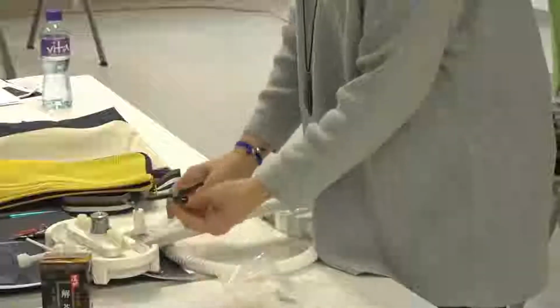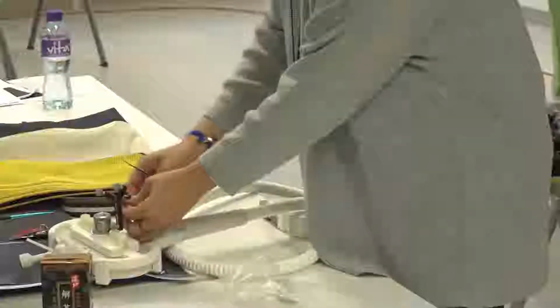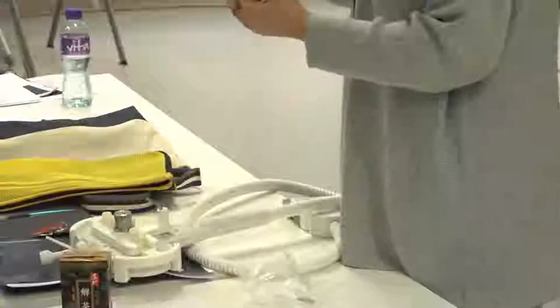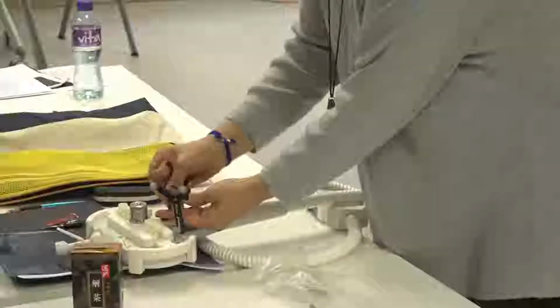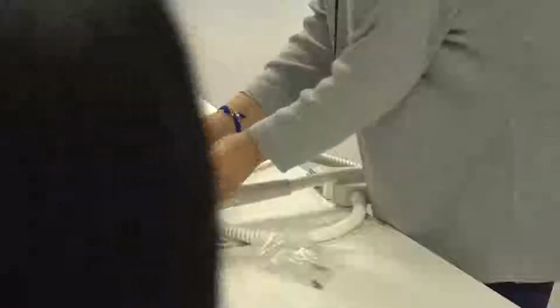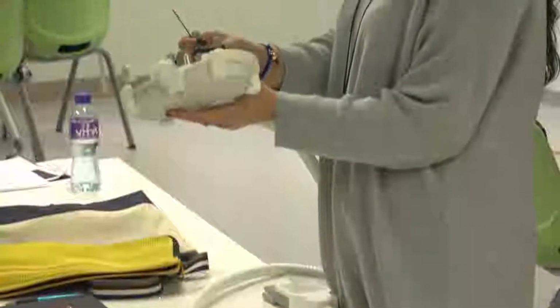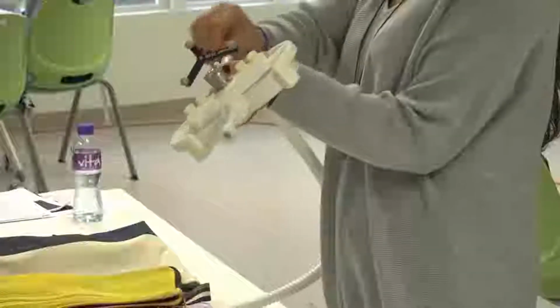So the same thing as I did before. You attach this here and then here, and then tighten it here so that it doesn't move.